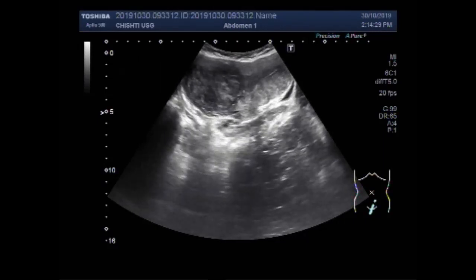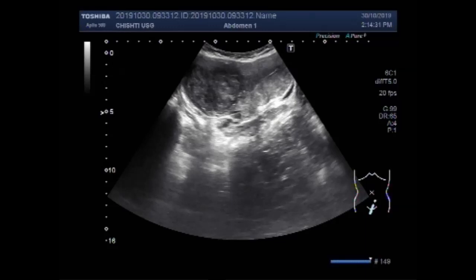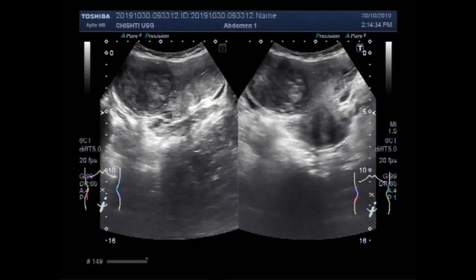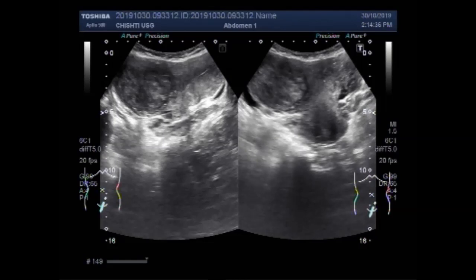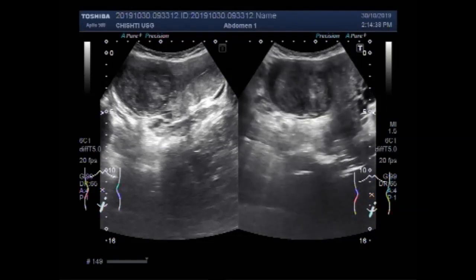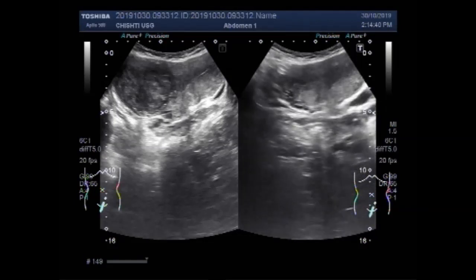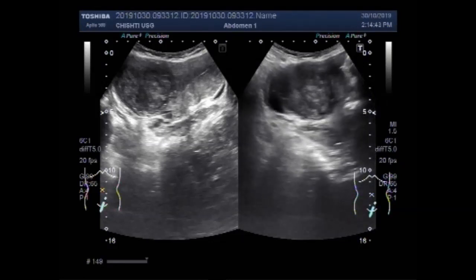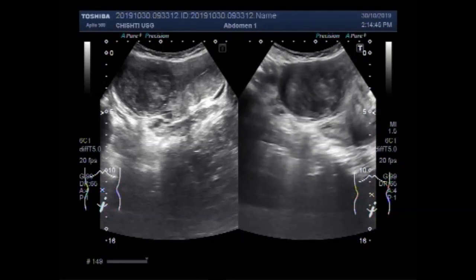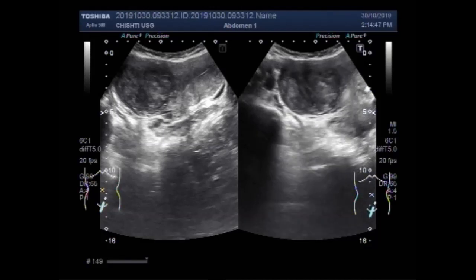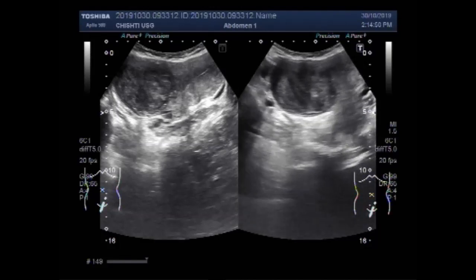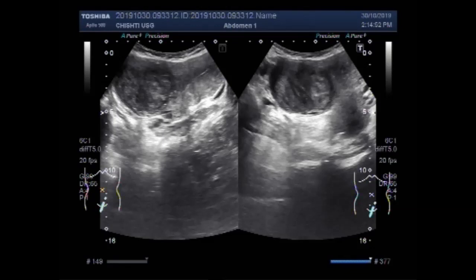It appears to be a pedunculated fibroid — a large fibroid. It is round to oval in shape, semi-solid to solid in consistency, and slightly echogenic. This is the right ovary and this one is the left ovary.